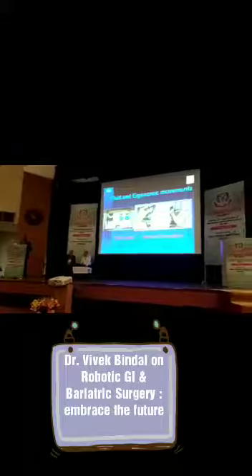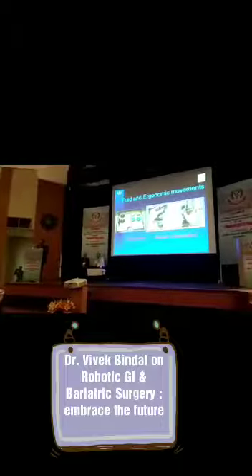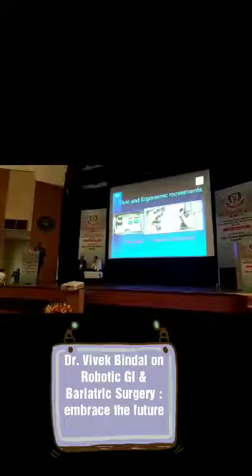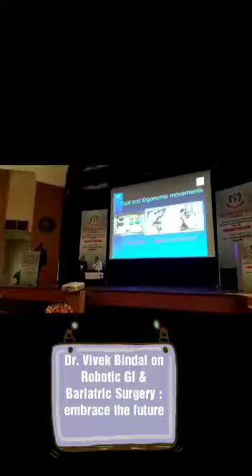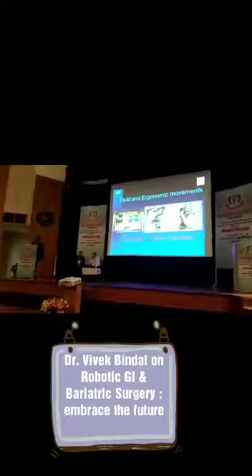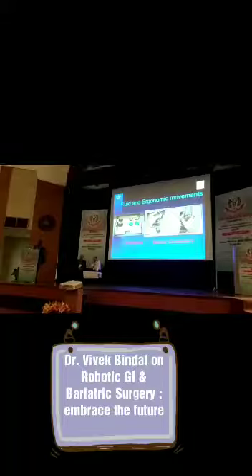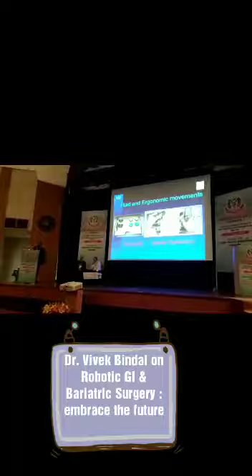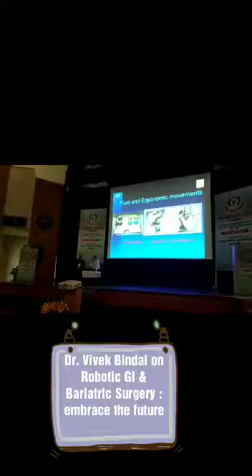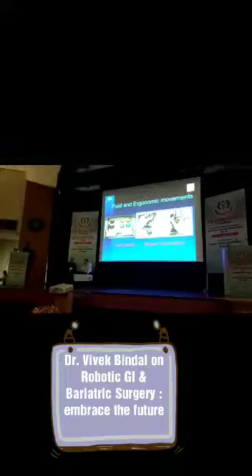If I am to do a fine job, like suturing on the aorta, in a robotic system I can do a fine setting of 5:1. What that means is, if I move my hand by 5 centimeters, the tip of the instrument moves by just 1 centimeter. So even if the surgeon is not trained in very fine techniques, the robotic system can help the surgeon do a better job.